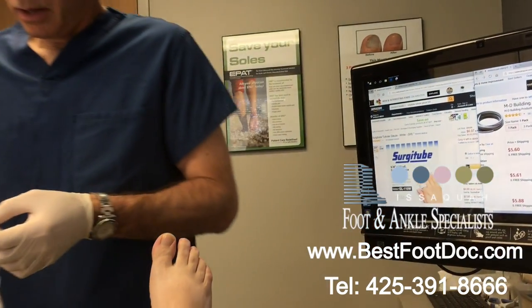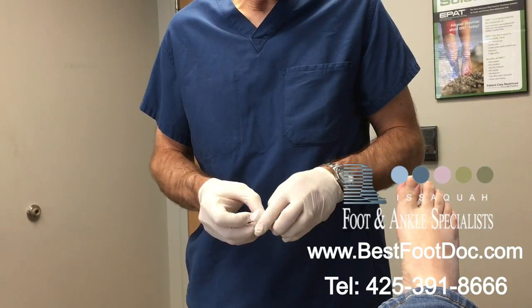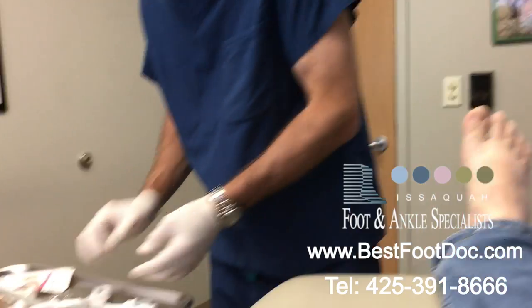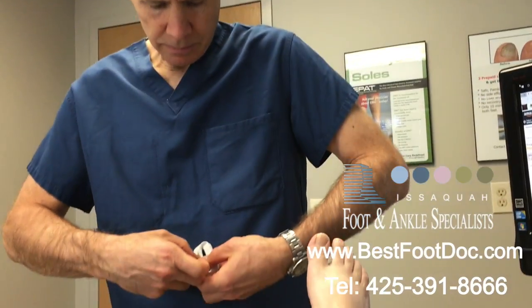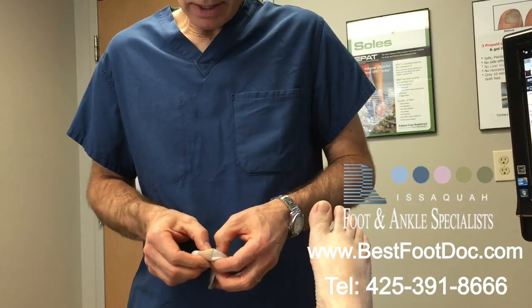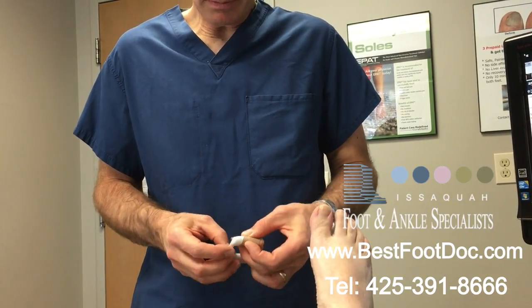There are different ways you can do this, but here's one way. You've got this tubing — you flip this thing up here, flip that up there, and then you just want to tape it in place. I'm taking the gloves off because gloves and elastic tape really don't mix. You take this and just wrap this elastoplast around here, and you could go just around a couple of times.